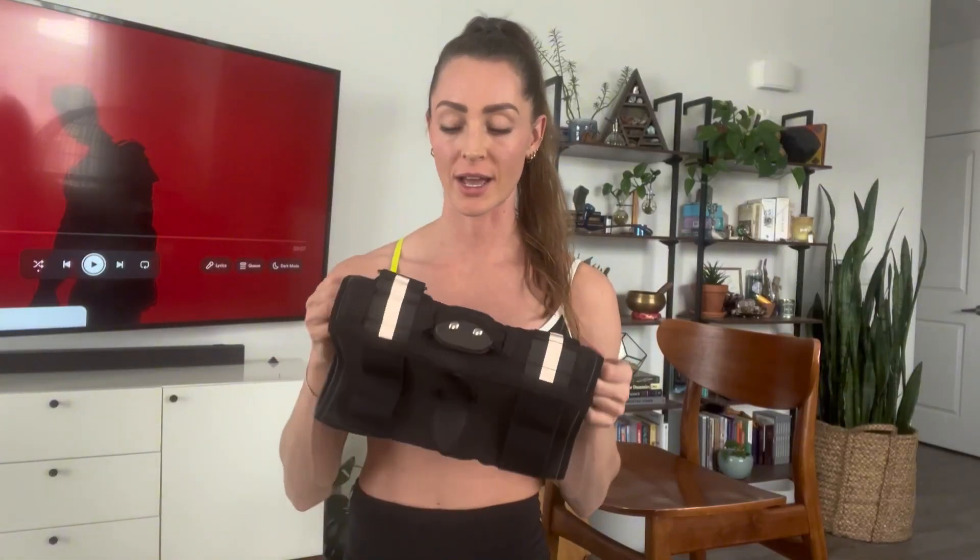I'm on my way to go do some volleyball, but first I do need to wear a knee brace. Lately, sports have been kind of hurting my joints and my knees, so I bought this new knee brace and I'm pretty excited about it.